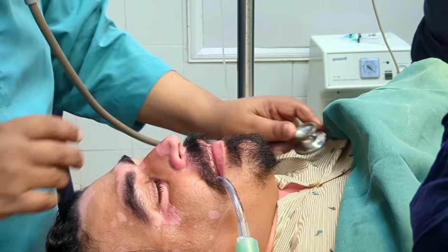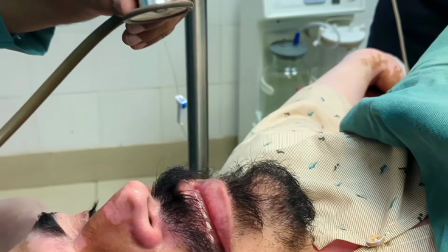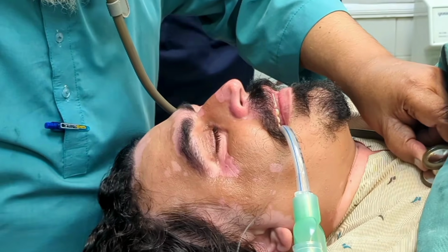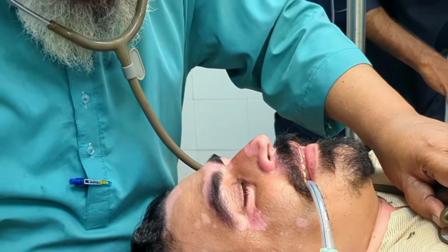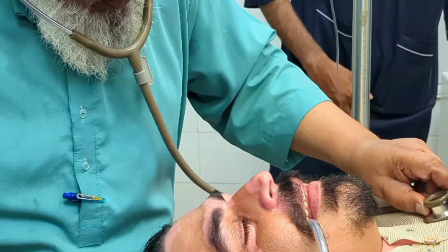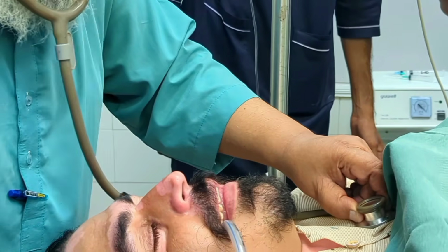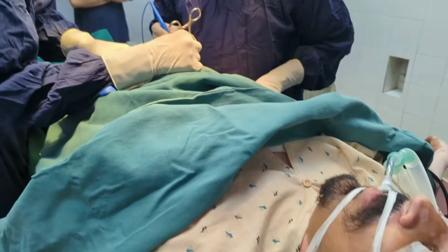The stethoscope was placed on both sides of the chest, just below the clavicles, to listen for air entry. Equal breath sounds were heard bilaterally, which confirmed that the tube was correctly in the trachea and oxygen was reaching both lungs. Auscultation was also done over the epigastrium, the upper part of the abdomen, to ensure that there were no air sounds in the stomach, which would indicate accidental esophageal intubation.